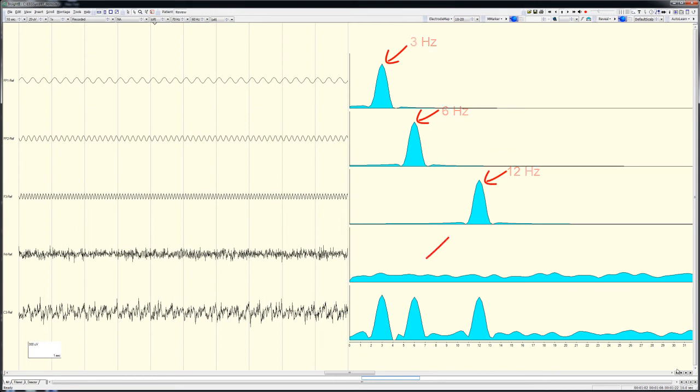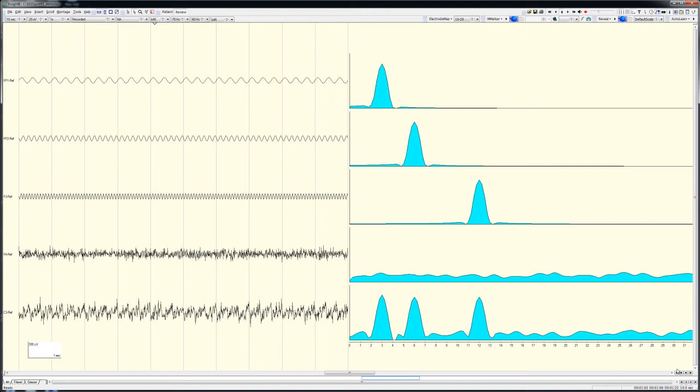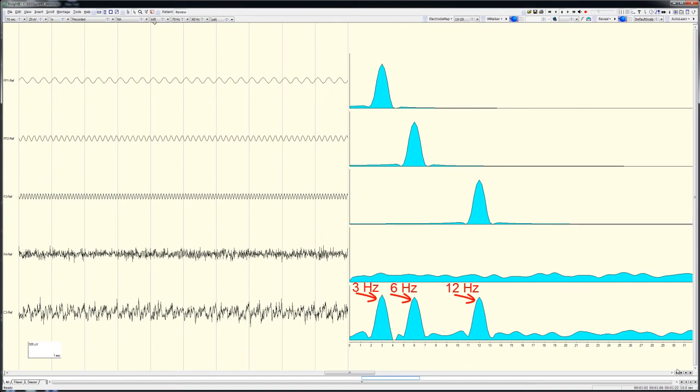The white noise trace shows fairly similar activity from 0 to 32 Hz. Of greatest interest for this demonstration is the FFT output for the final, more complex trace. Notice that three discrete peaks are evident. These occur at 3, 6, and 12 Hz and are superimposed on a lower amplitude spread of diffuse activity from 0 to 32 Hz. The FFT has successfully split the EEG-like signal into its underlying components.